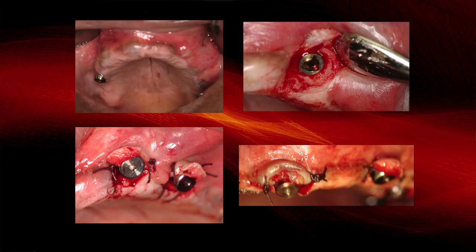And the tissue is like water. How it heals, it seeks its own level. So here it'll be nice and blended. And maybe the next time we meet, we'll be able to show you this case that's finished.